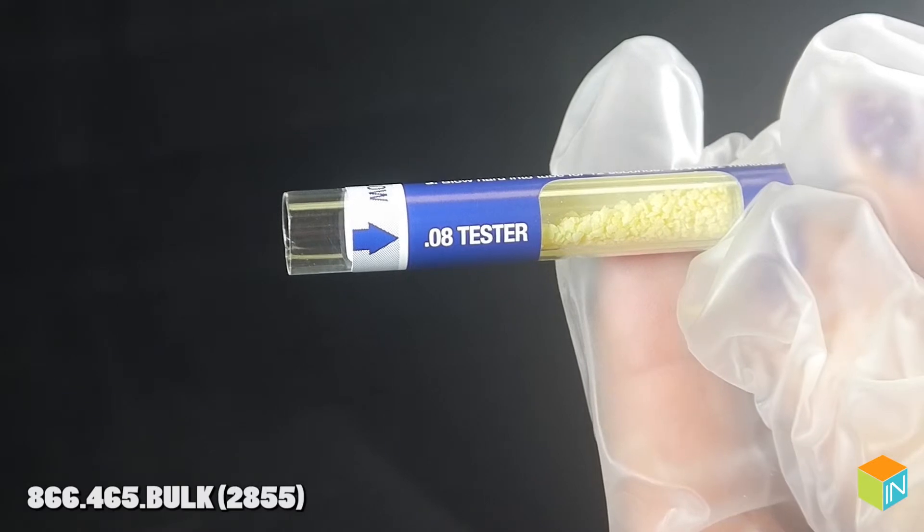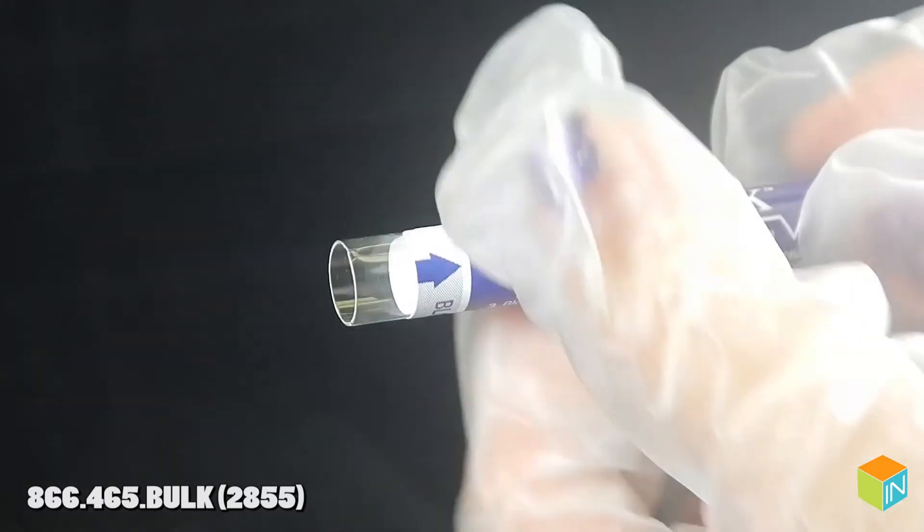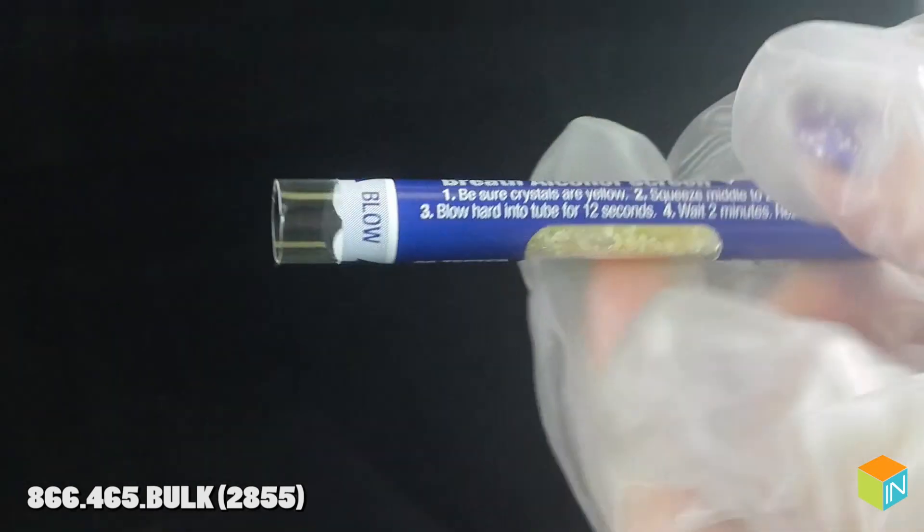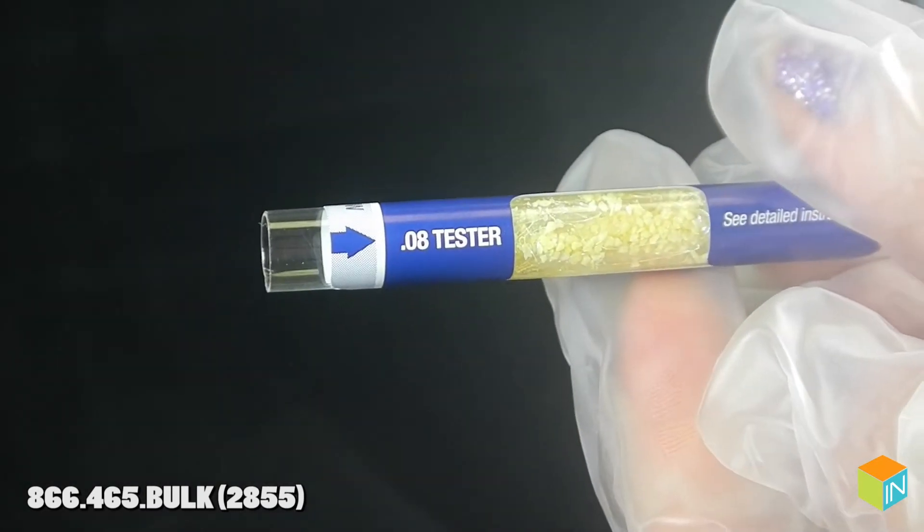Step 2: Squeeze the middle of the test to break inner glass capsule. Squeeze only once. Do not bend or twist. Rotate to distribute the crystals in viewing area. Use test immediately.